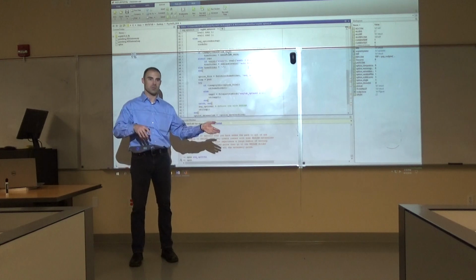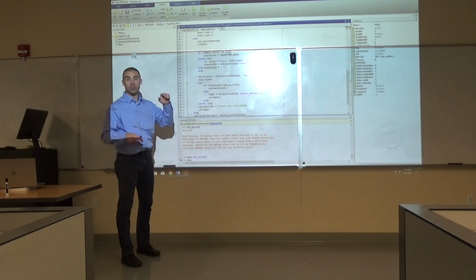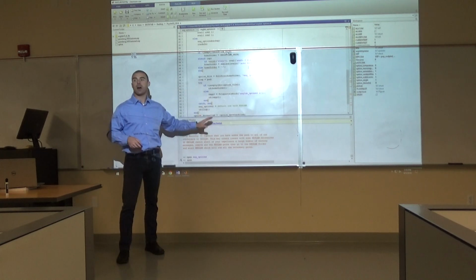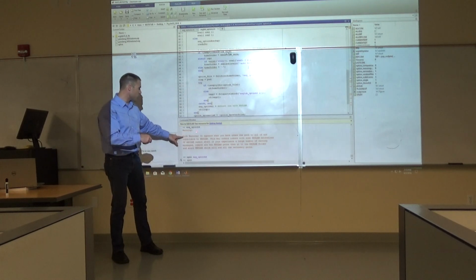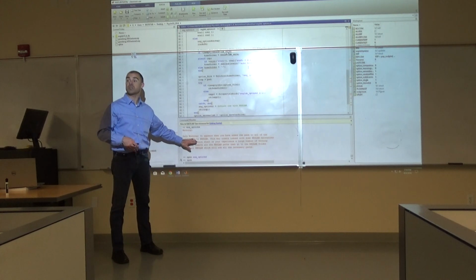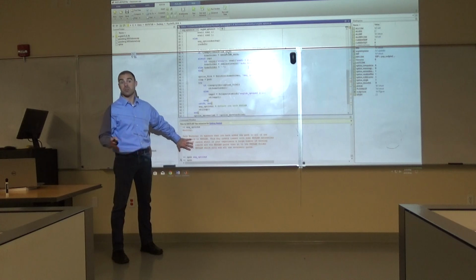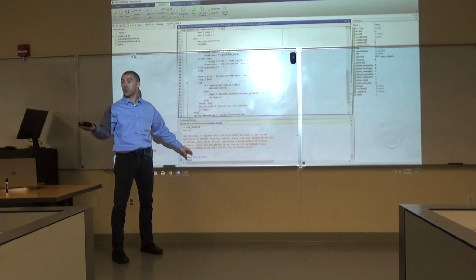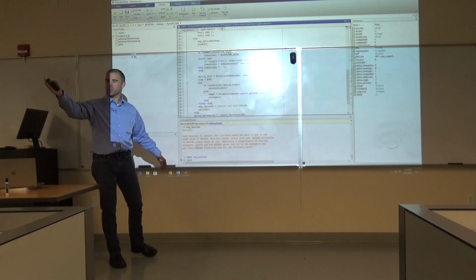Go back to start. And when you do that, it stops it from thinking, and it'll actually spit out in the command window some of the errors that were holding it down. It'll come up in red text. Now, for some reason, my computer was fine. It didn't have this error, so I can't show it to you down here, but you'll see it in yours when you do it.